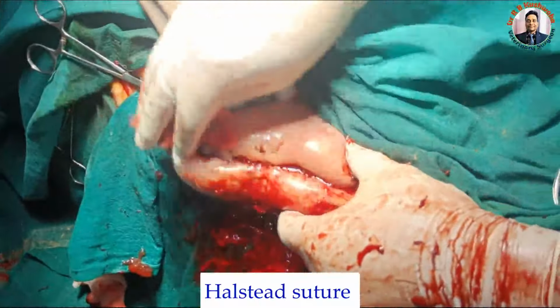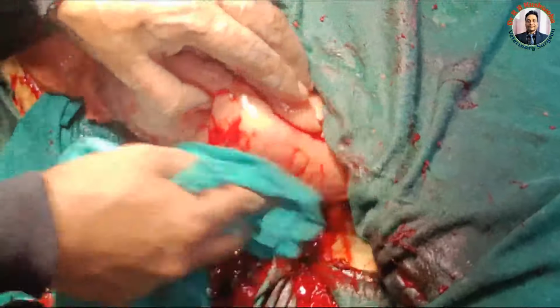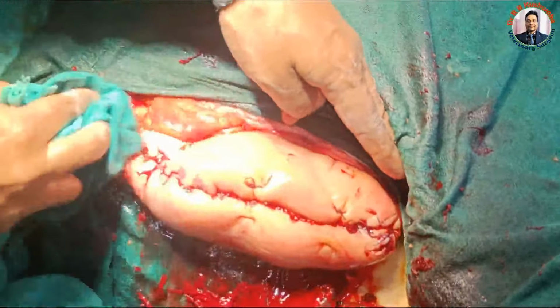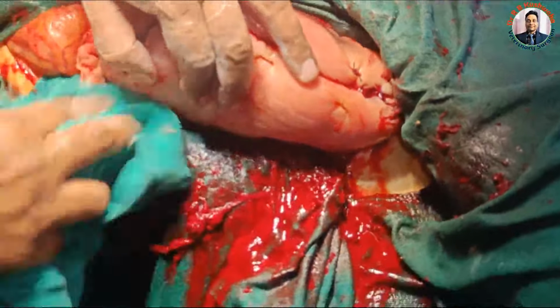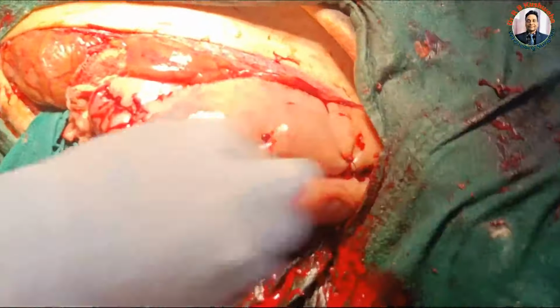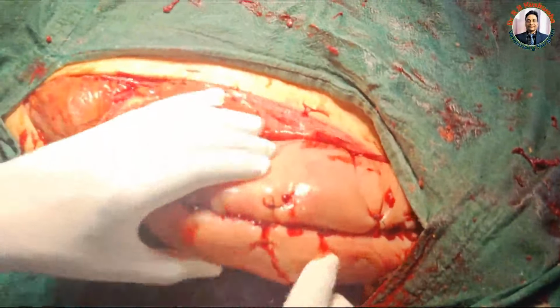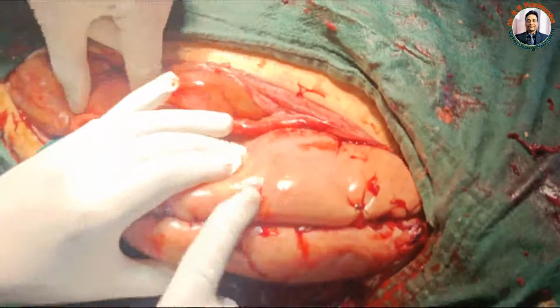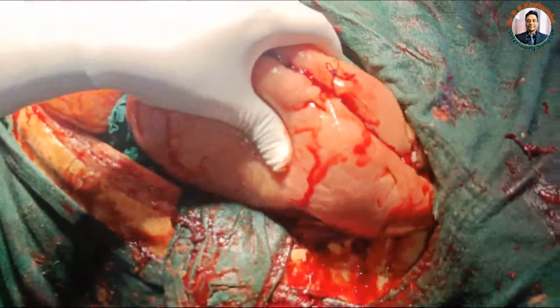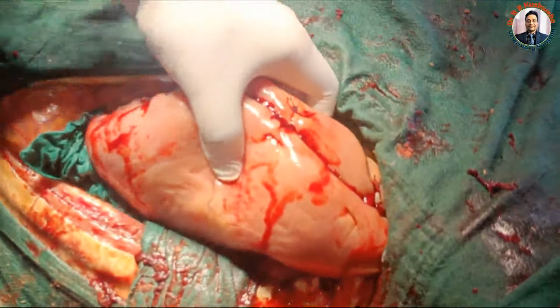And this much is sufficient. Only 2 is sufficient. So you could see we have repaired this uterus in 2 layers, and we further reinforced with this 2 Halsted suture, because the uterus was leathery. So we have inserted how many? 4.